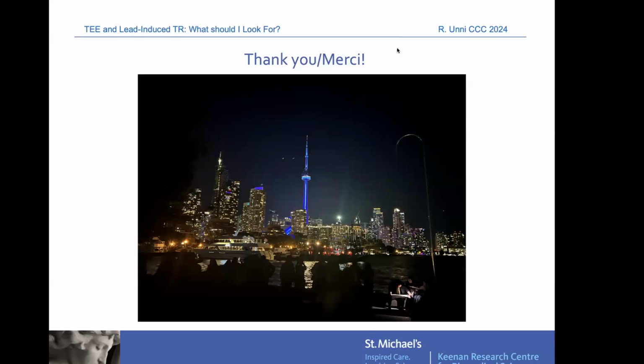Obviously, you need very, very good image quality to obtain a good 3D data set to play around with. So again, it's underutilized. It's all practice. Practicing subcostal is one of the best views, or even the short axis. If you have a skinny person, you can get off a little bit medially to get that view as well.